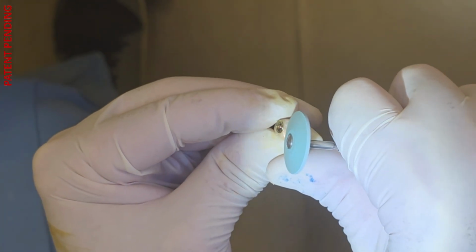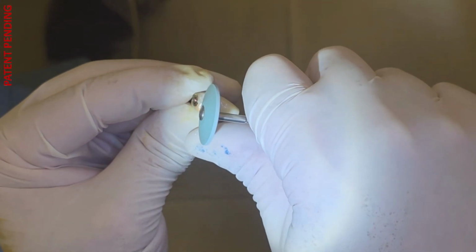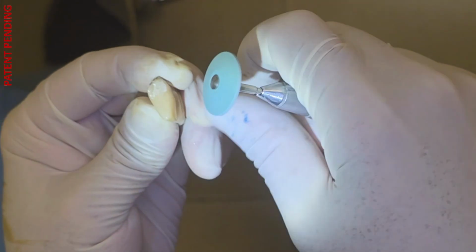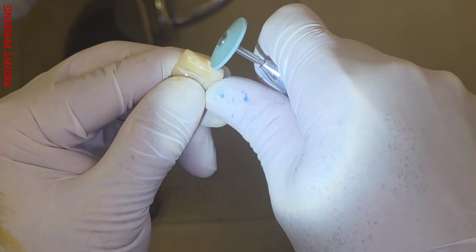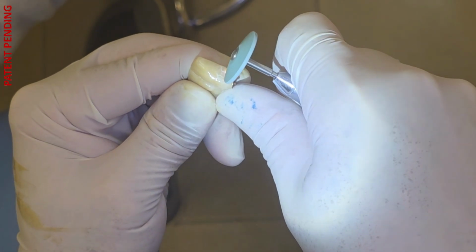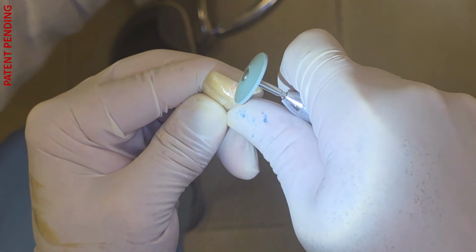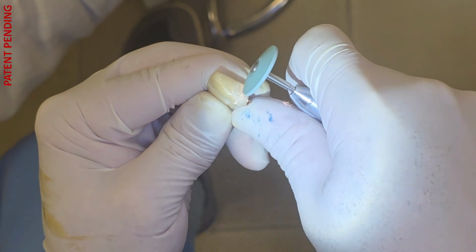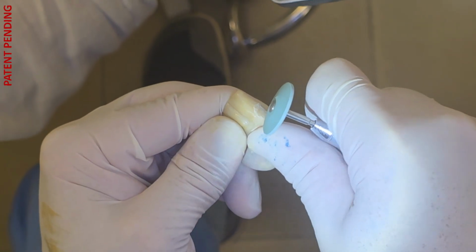A green stone disc is used. Why choose a stone rather than a diamond disc for adjusting zirconia? When friction occurs, both surfaces heat up. Stone wears away quickly, and the detached particles reduce heat in the contact zone. Diamond instruments do not wear away. Both the burr and the zirconia heat up, which can damage the material. Thus, stone is preferable for zirconia finishing.